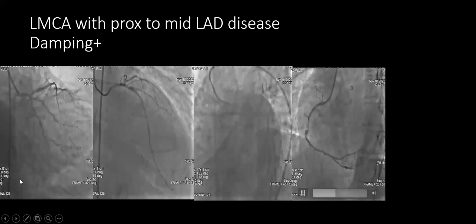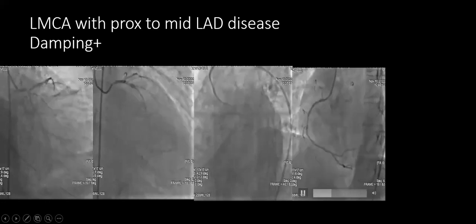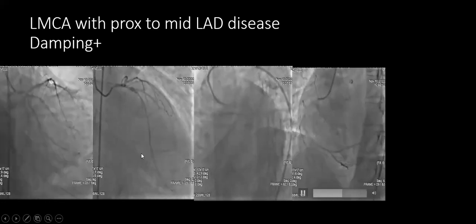But this patient had real cost constraints, right? He was an ECHS patient. And I thought, okay, I will try to pre-dilate with a balloon and go ahead. But after this balloon dilatation, the patient went into severe hypotension, complained of severe chest pain, and arrested.